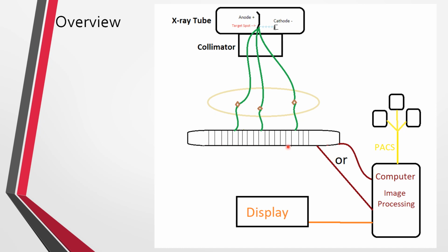This signal will be processed and converted to a form that the computer can understand. It will be sent either with a cable, with cords connected to it. In a lot of rooms, when you put it into the bucky of some sort, it has a cable attached here, or it could be sent through the air via Wi-Fi. This is a wavy line, so it's an electromagnetic wave.